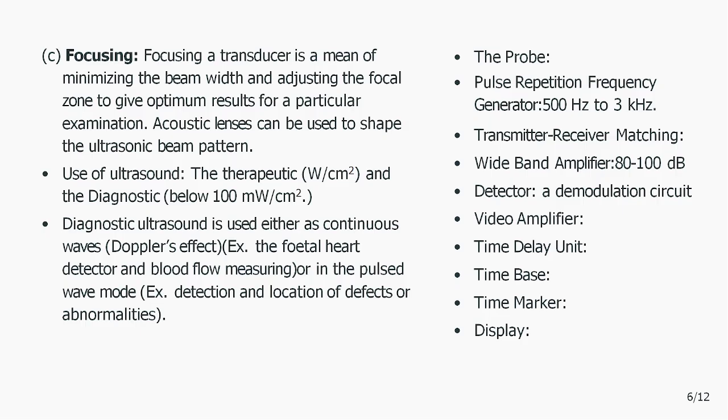Now, the use of ultrasound in medicine can be for two purposes. One is therapeutic, where they are using high power ultrasound in terms of watt per centimeter square, and the other is diagnostic ultrasound, which has power below 100 milliwatt per centimeter square.